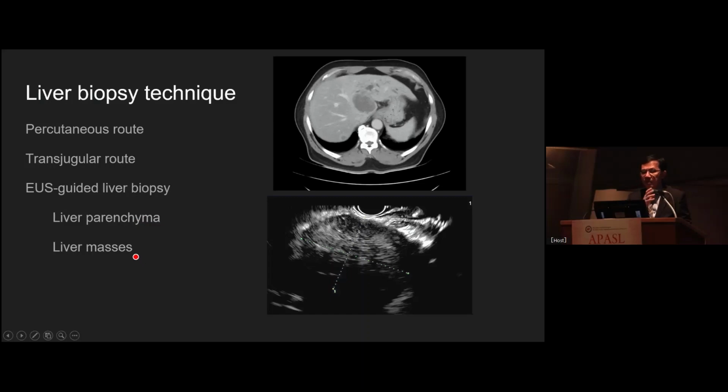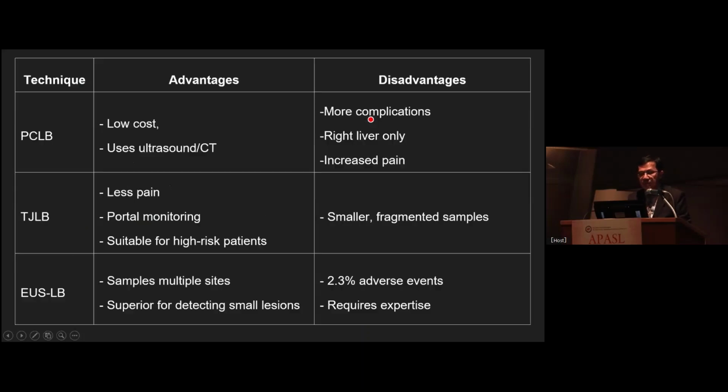And most of the papers we've discussed are about the liver parenchyma instead of liver mass. I think the problem about liver mass is about identification. Where is the lesion? Today we had a nice lecture from Professor Hara on how to identify and where to identify. The biopsy from the liver mass doesn't cause much trouble. The imaging of this patient is very easy because it is close to the antrum and duodenal bulb.